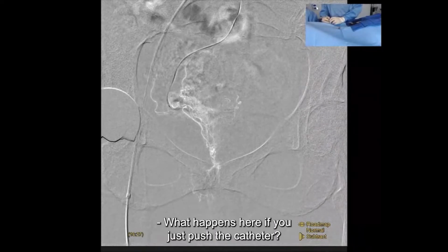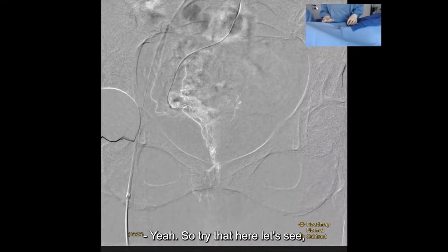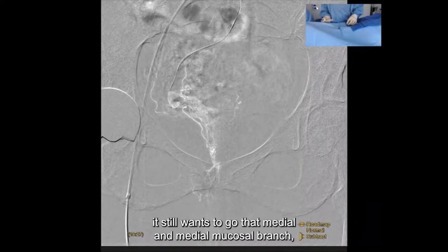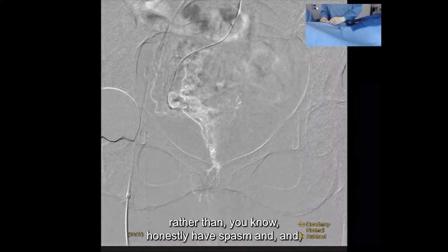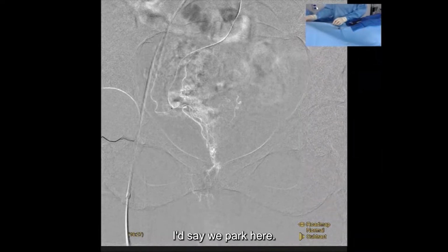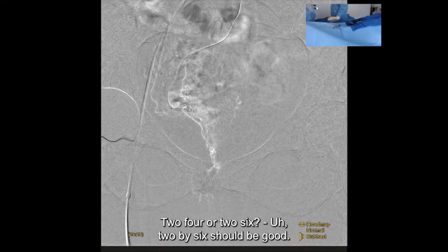And what happens here if you just push the catheter? Yeah, so try that here and see. I think it looks like no matter what, it still wants to go to that medial mucosal branch. And rather than have spasm and go for something that can be more distal here, I'd say we're going to park coil it here. Yeah. I'll take a 2 millimeter coil. 2 millimeter. Gotcha. 2x4 or 2x6? 2x6 should be good.